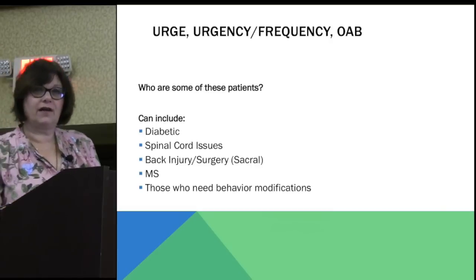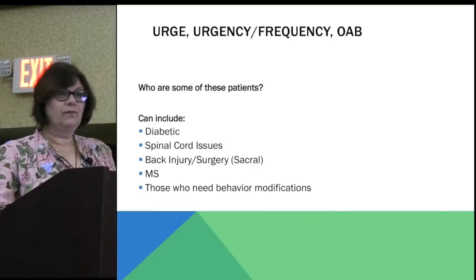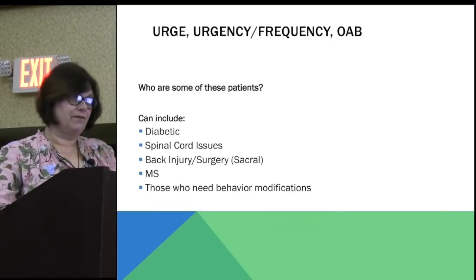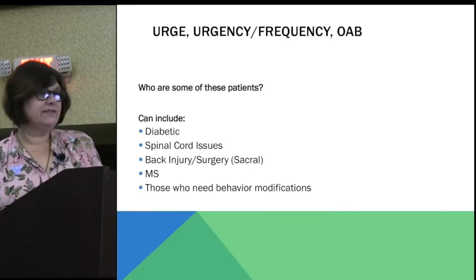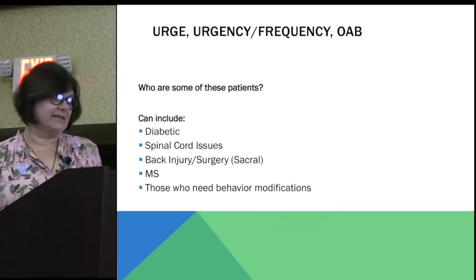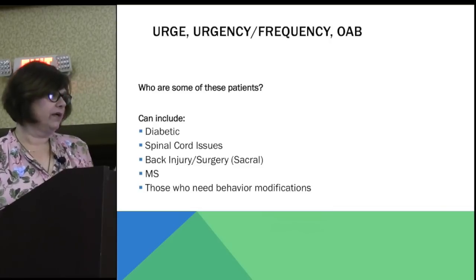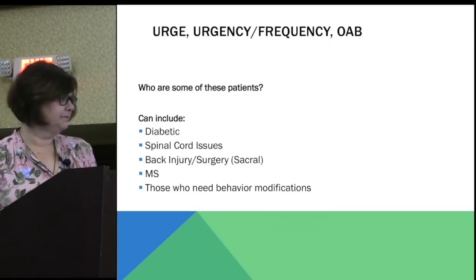Yeah, the quick flicks he's talking about. It's a little quick. If the patient's starting to have a spasm, those of you who are familiar with pelvic floor therapy, we ask the patients to squeeze the pelvic floor muscles. We ask them to squeeze as if you're trying to stop from passing gas. Do that very quickly, so kind of a squeeze, relax, and that may settle down their spasm.